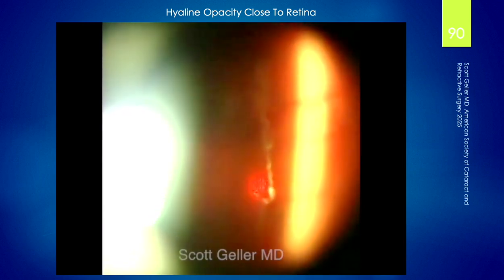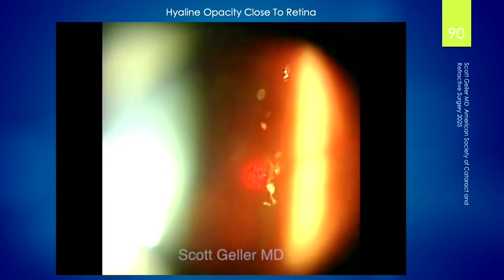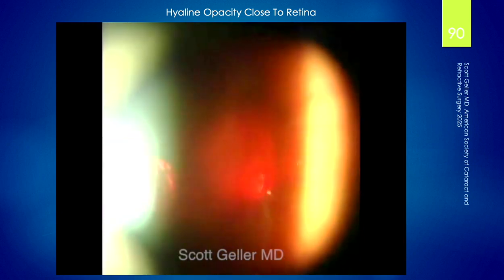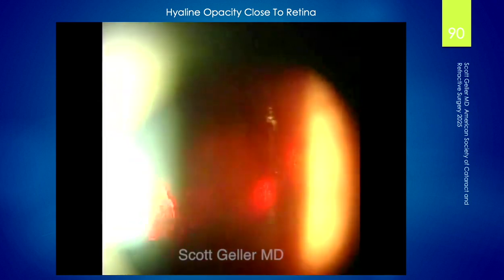And you can see how the particles are dispersed. You have to go after these little dispersed particles, but you can get them. Look at that little tiny thing, it's probably 50 microns.